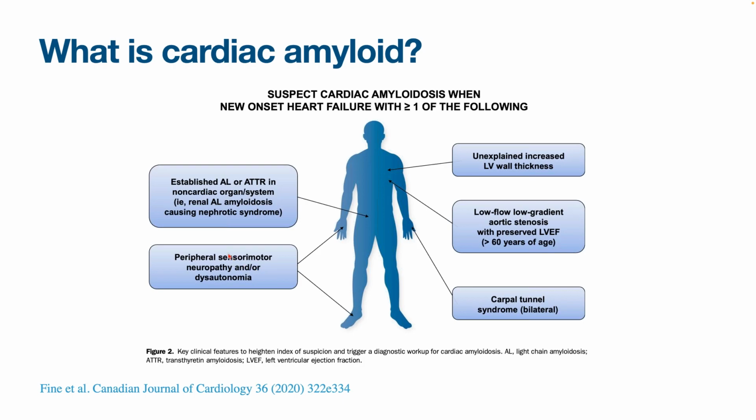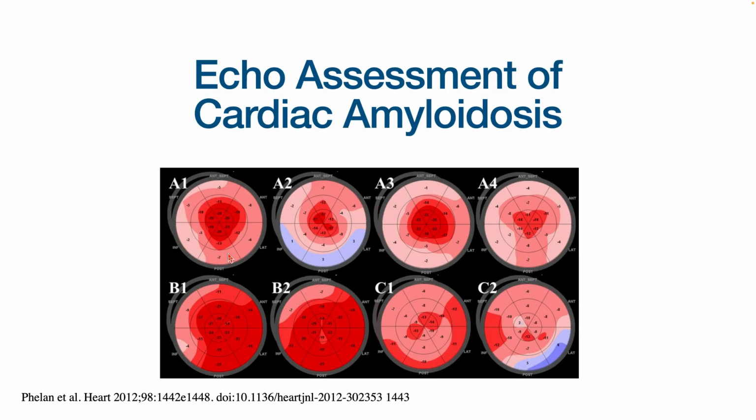So again, those are all the clinical symptoms that we would look out for in this kind of situation. More specifically, now let's go to the echo assessment of cardiac amyloidosis.